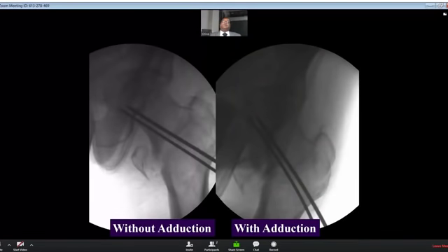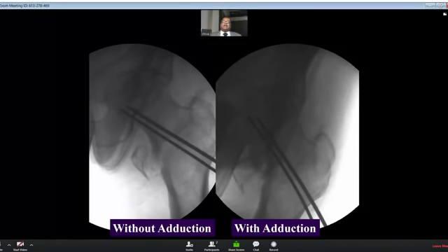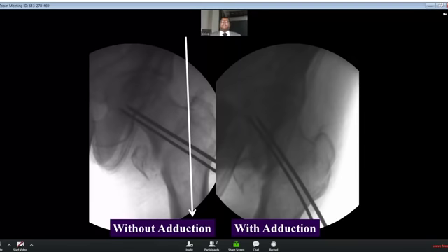And normally 2 screws are fixed 1 centimeter apart. At the left, you can see the AP picture, they are fixed. Once I have fixed the fracture, I can adduct it. I am least worried about varus happening. Without fixing this fracture, if I adduct the limb to insert the nail, varus at the fracture happens, and superior opening of the fracture happens. That's why we should fix the wires which are very anteriorly placed.